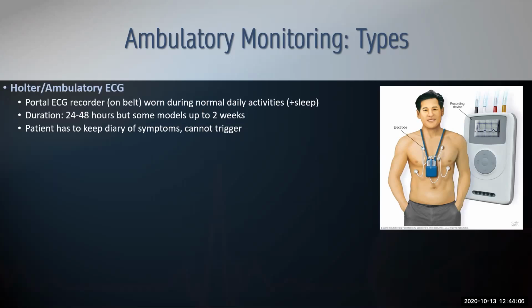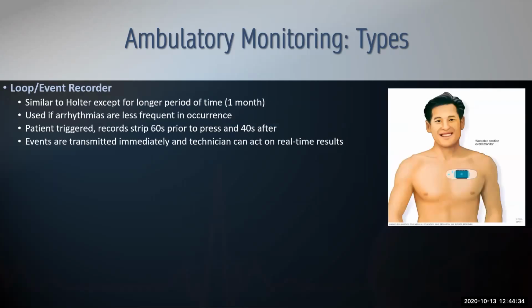If you have a person who has triggered symptoms, meaning, hey, I know I'm having these symptoms, I can feel the palpitations, Doc, what do you think that is? We're going to talk about doing a triggered monitor, but this would be for someone who maybe has syncope that's happening on a daily basis or every 2 days, or you're concerned they had a stroke and you want to see, maybe in the next 24 to 48 hours, and you can do up to 2 weeks as well, are they having any bouts of atrial fibrillation, which would account for maybe why they had that stroke.